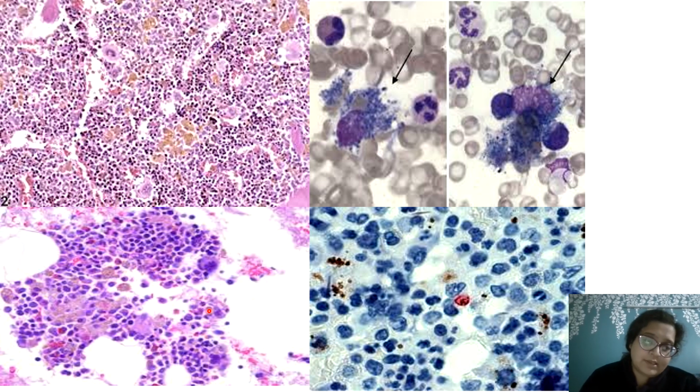Okay. Then sometimes similar in color, lesser in quantity, and within the cell, if you can see over here and over here, you see some orangish pigment, and then you see that there are two dots inside. These are malarial pigments. So sometimes in the marrow, when the malaria has disseminated and is too much, you might get to see these malarial pigments. Contrasting to these pigments, and they are also fineish orangish, now you come to the coarser looking pigments.